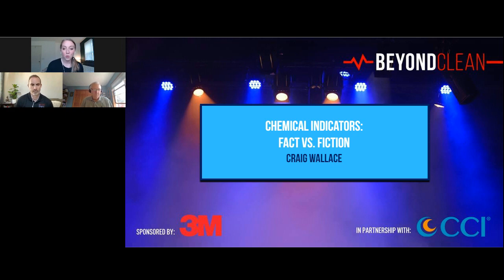Craig, just a quick question for you. Do you have an example for what a type 6 chemical indicator would be used for? So the application, as I had mentioned, is typically going to be a pack indicator, which is the most common use. People will use it for the same thing you would use a pack indicator for on the inside of the pack. The key, as we covered today, is to look at that to make sure you understand what that tells you.